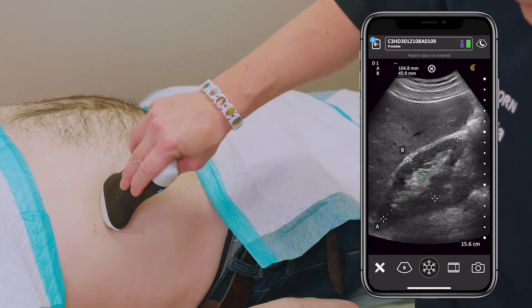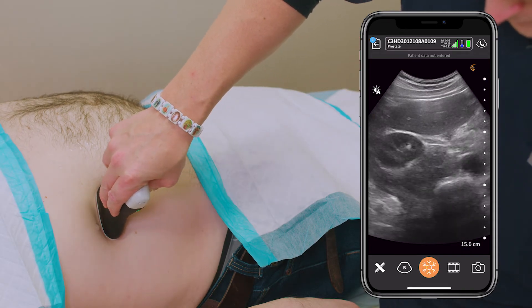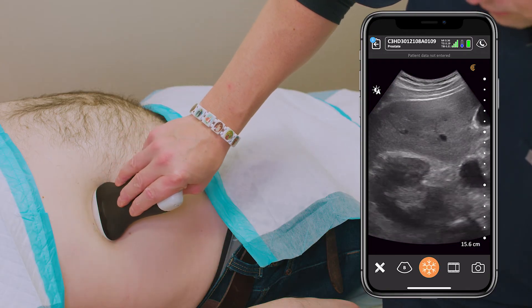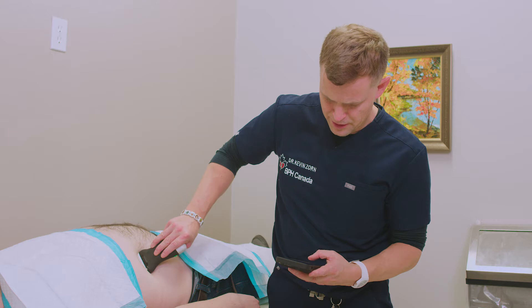We'll do the same on the left side just momentarily. Perusing from lower pole to upper pole, I don't see any evidence of any calcifications, stones, or tumors. I'll repeat now on the left side — place on our gel.